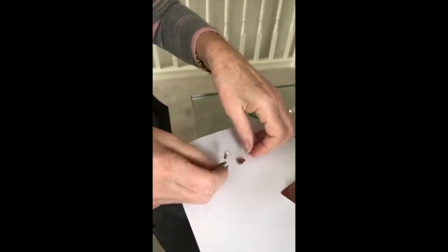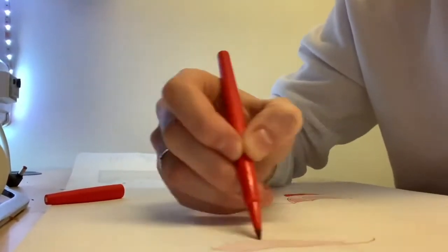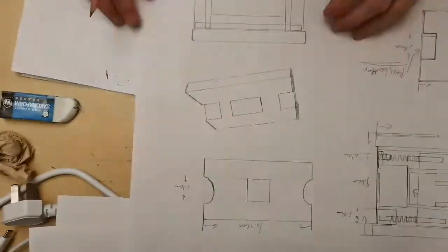I find that the batteries go flat very quickly. Trying to change the batteries in a restaurant or at someone's house is very, very fiddly. So trying to do something that's terribly delicate is very difficult. We decided to focus on the issue of changing the batteries, making it easy to change the batteries on the go, and encouraging her to use her hearing aids more often.